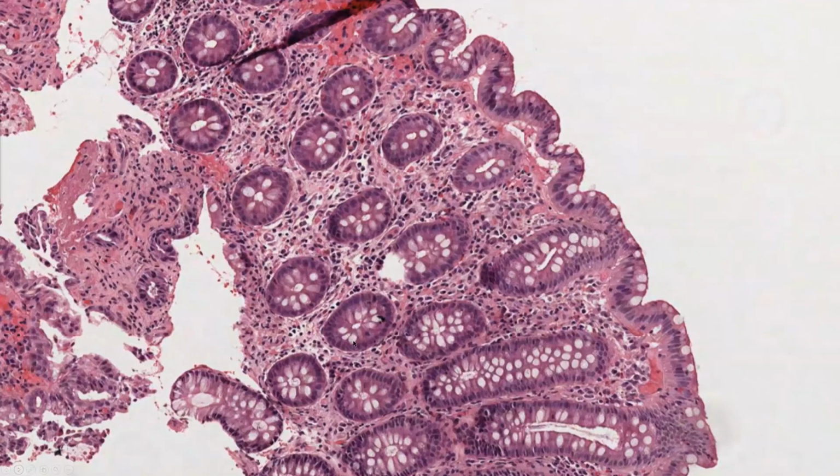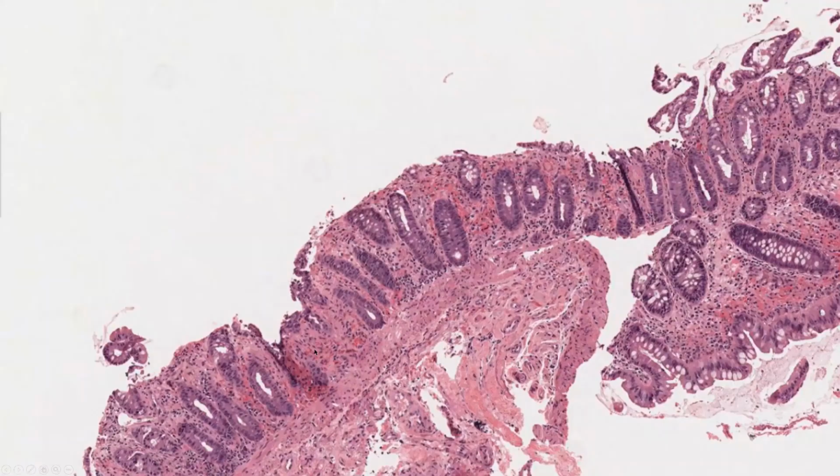Now then, let's go to this other area that I have highlighted, where I showed you that the surface epithelium was lost. If you look at the surface epithelium here, you can see that it is falling apart. You can see it just a little bit here, still present, but here it's falling apart. This is not a preparation problem.